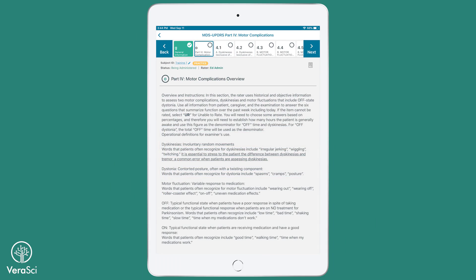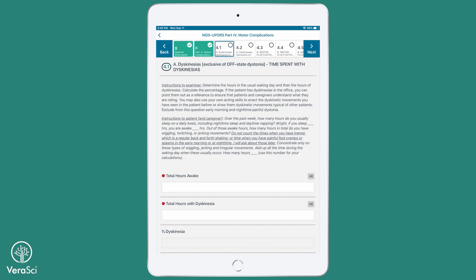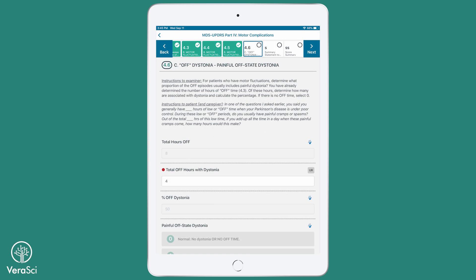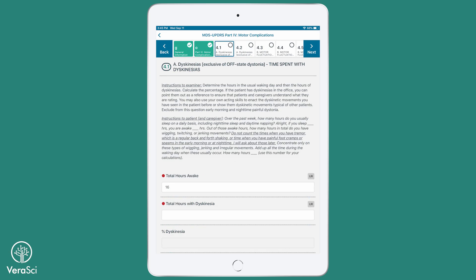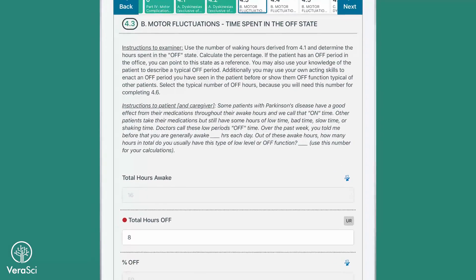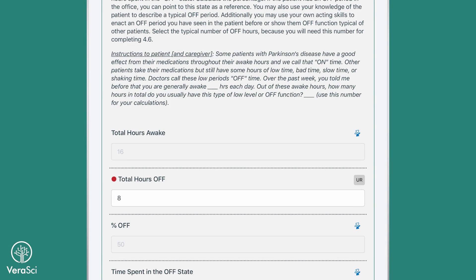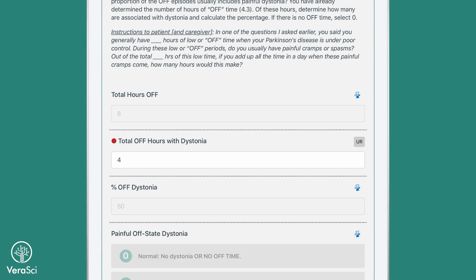Part 4 of the MDS-UPDRS is used to assess dyskinesias and motor fluctuations that include off-state dystonia. The clinician enters the number of hours the patient typically spends awake and then records how many of those hours include dyskinesias and off-state dystonia. After the clinician enters a value for total hours awake and total hours off, Pathway will automatically pre-populate subsequent items which ask for these values.